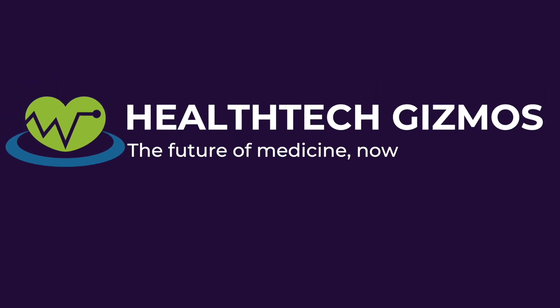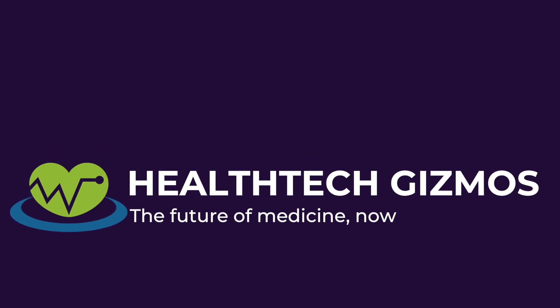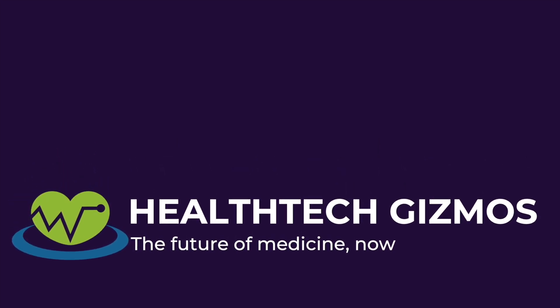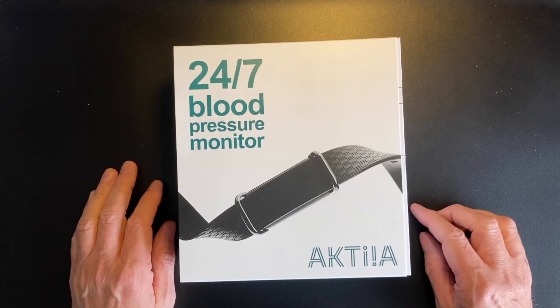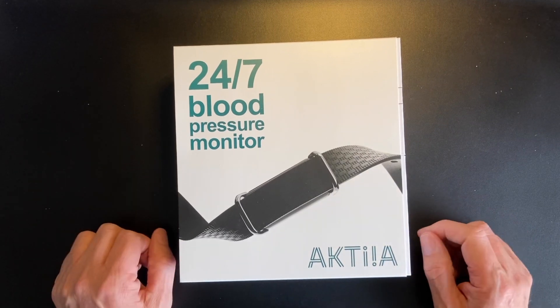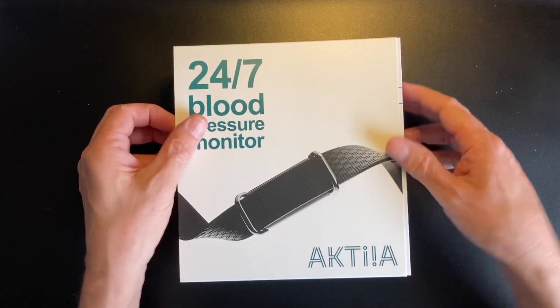Health tech gizmos — the future of medicine now. In today's video, we're looking at a new and novel blood pressure wearable from a new company called Actia.